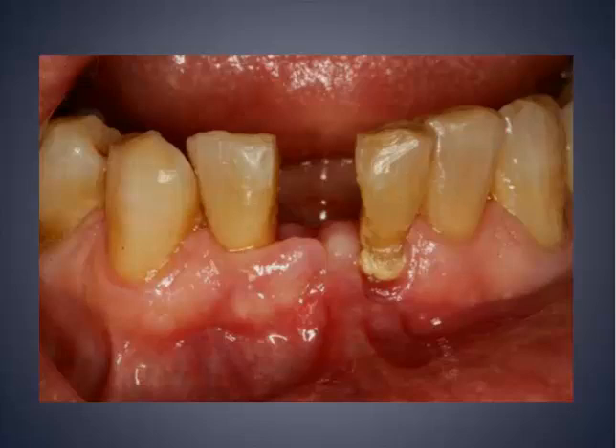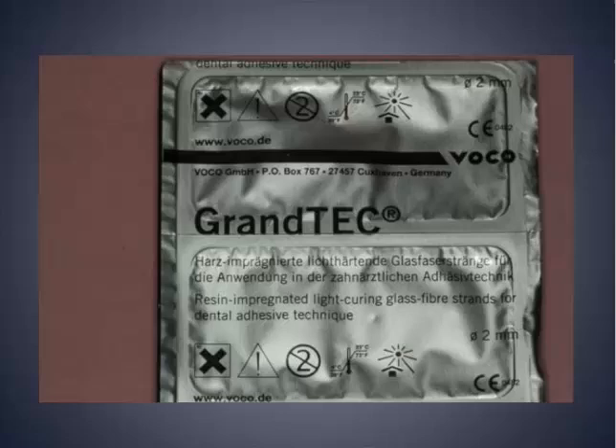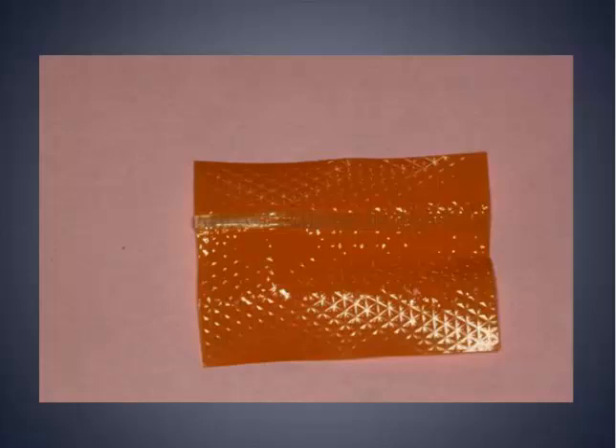It's in the middle of my busy day. It's not about aesthetics necessarily, because her lips are going to cover most of this. You just need the tooth there — something presentable she can work with. So good thing I had Grand Tech sitting in the cabinet.